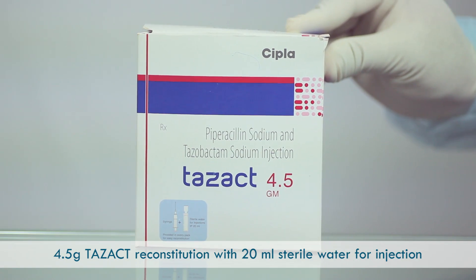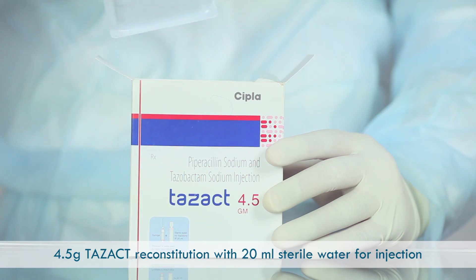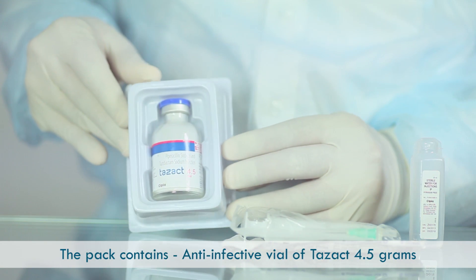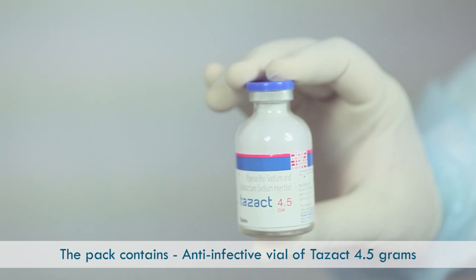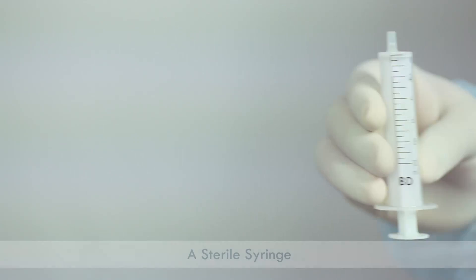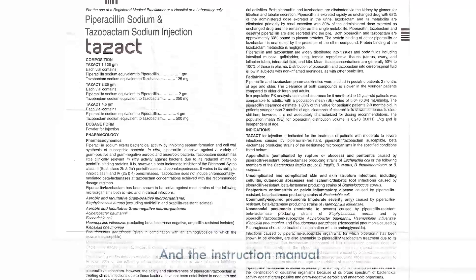Let us reconstitute TASACT 4.5g with 20ml sterile water for injection. The pack contains an anti-infective vial of TASACT 4.5g, 20ml sterile water for injection, a sterile syringe, a sterile needle, and the instruction manual.